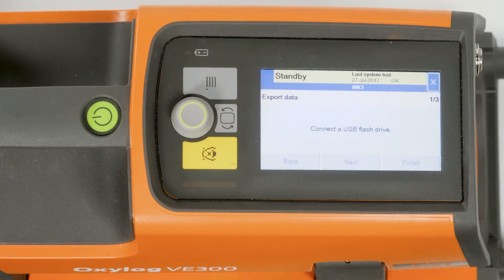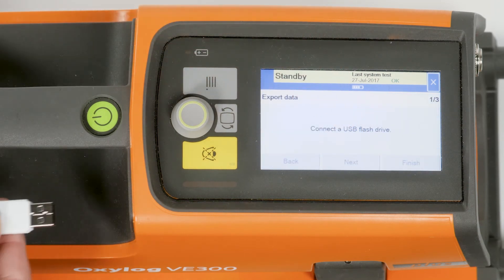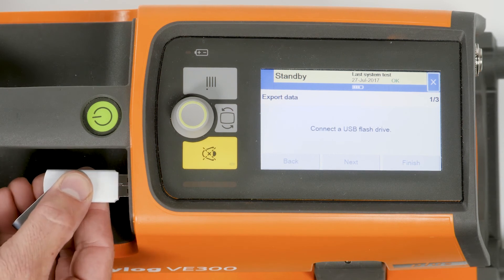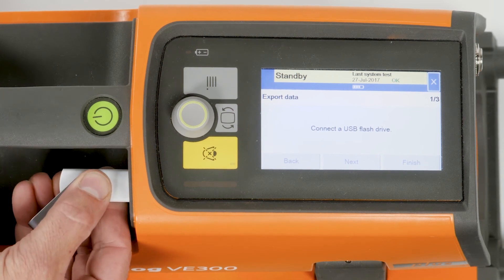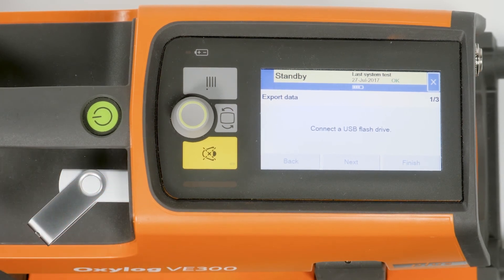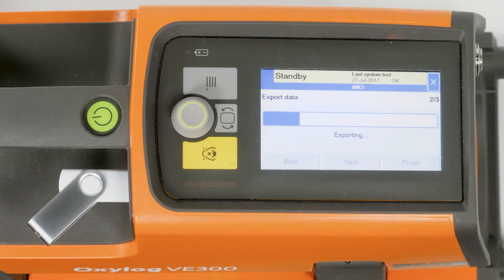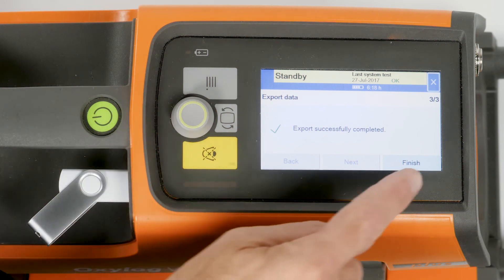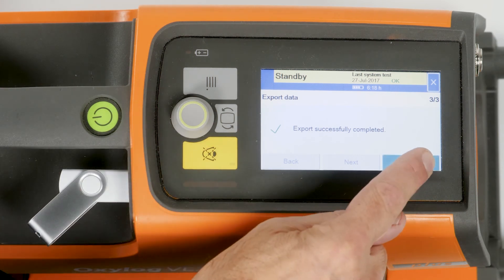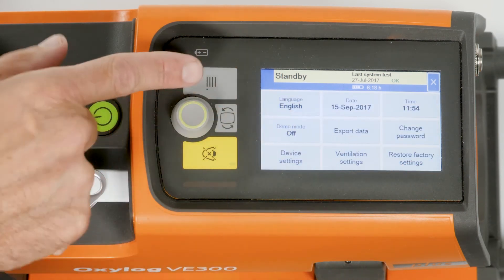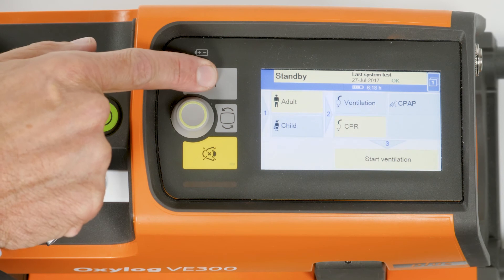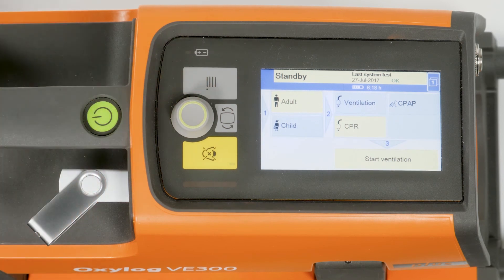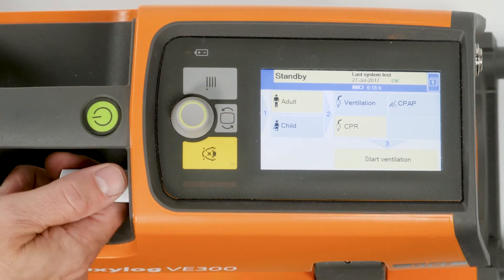Connect a USB flash drive. The device automatically detects the USB flash drive and transfers the saved data to it. A successful transfer is confirmed with the message: export successfully completed. Touch the Finish button to complete the export and remove the USB flash drive.